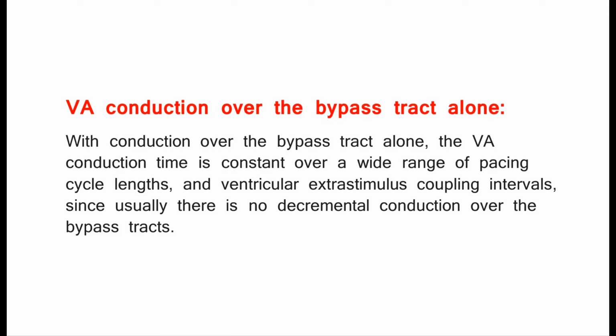VA conduction over the bypass tract alone. With conduction over the bypass tract alone, the VA conduction time is constant over a wide range of pacing cycle lengths, and ventricular extrastimulus coupling intervals, since usually there is no decremental conduction over the bypass tracts.